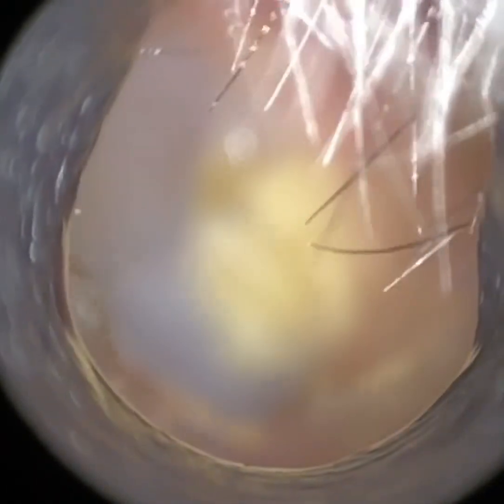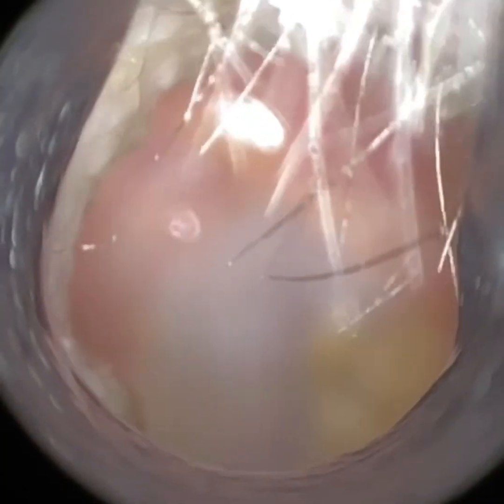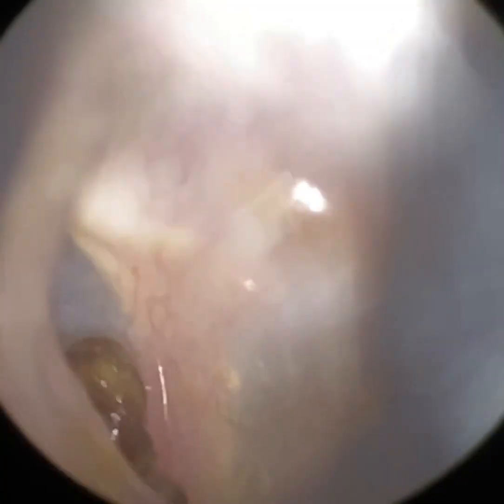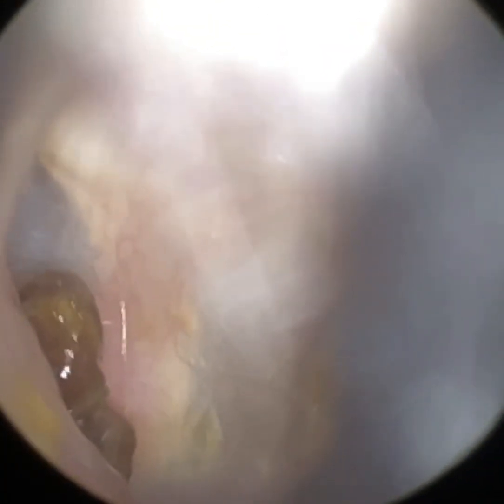Now, I've removed the majority of the occlusion, but now there's a bit of soft keratin on the posterior aspect of the TM. You'll see that in a moment when I get it in focus. But more to the left there, you can see just hiding away in the anterior recess — there's a bit of wax there.